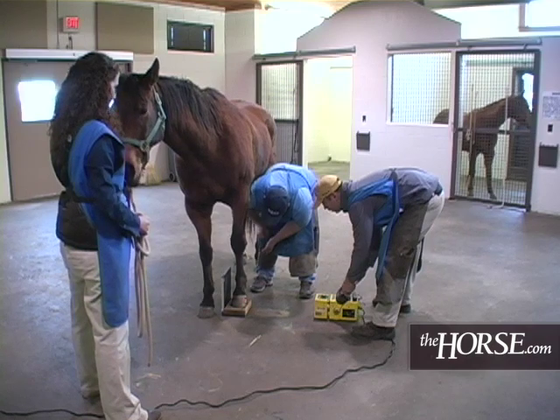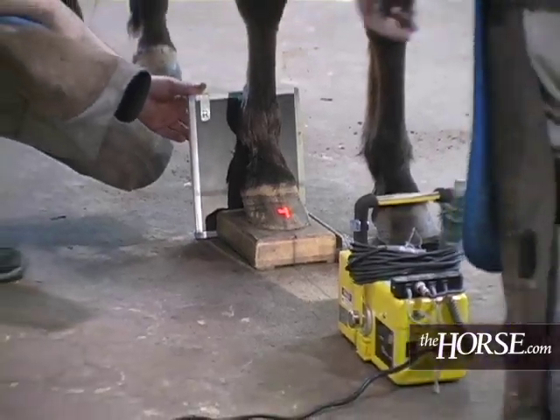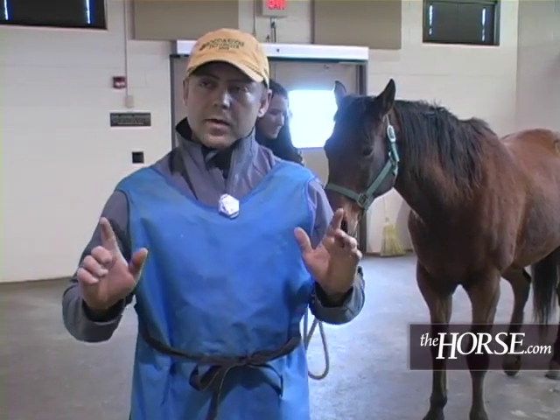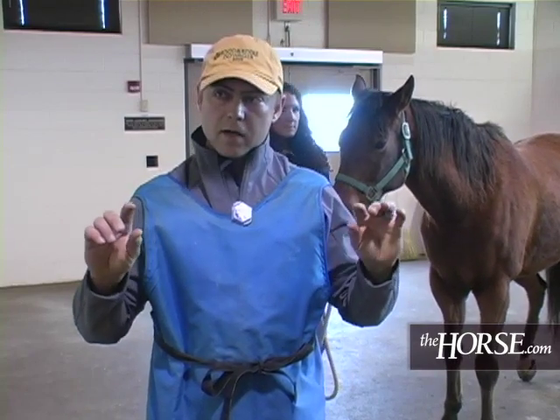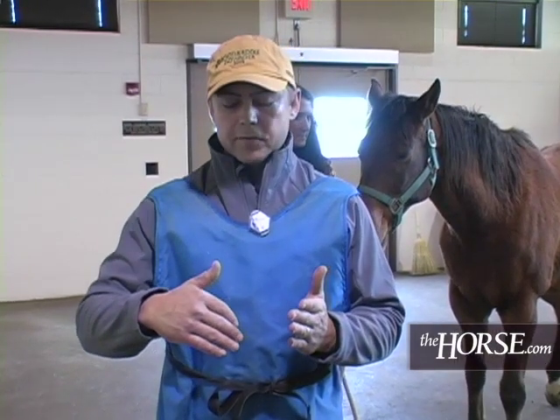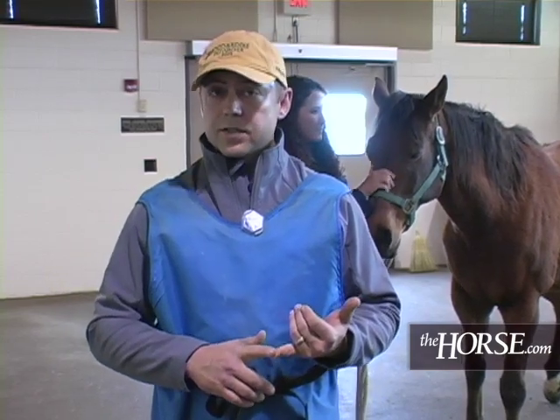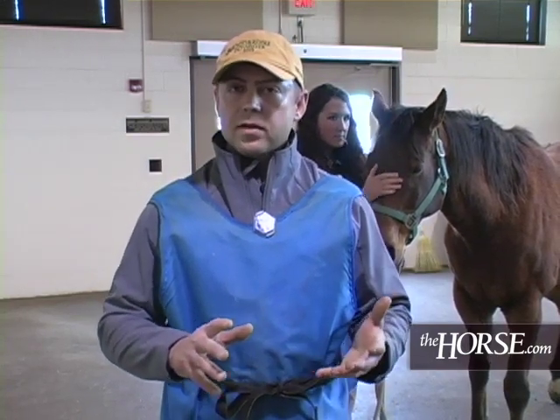The standard views we're going to take are a standing lateral, a horizontal DP — that's where the view comes straight on like this — and three views of a DV that goes from top to bottom, two of those being obliques so that we can visualize the wings of the coffin bone. And then we're going to take a skyline of the navicular bone, which really gives us good detail of the flexor surface of the navicular bone. All six shots are really important for finding and diagnosing what kind of pathologies are in the navicular bone.